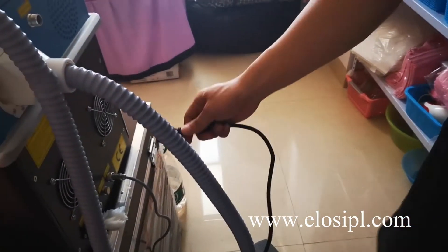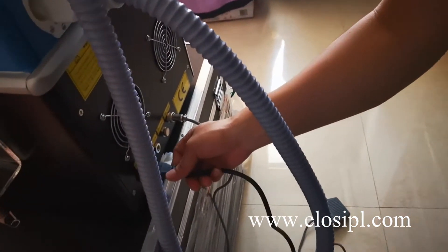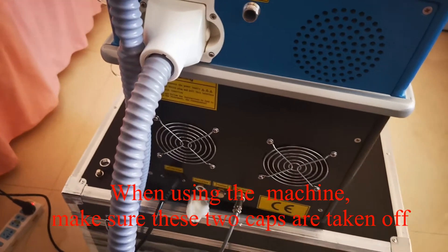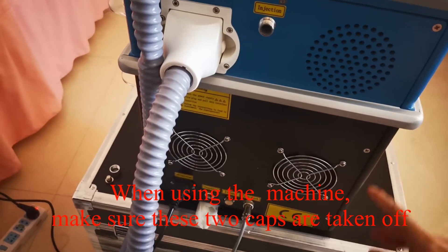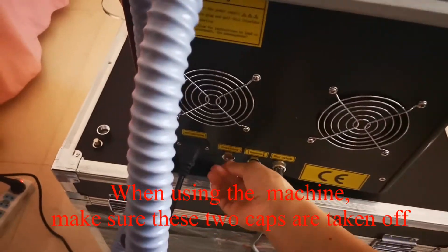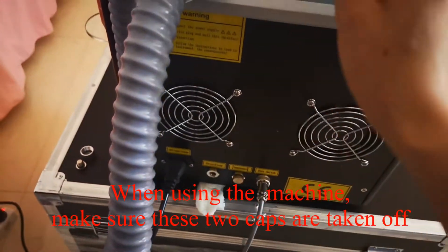Connect the power line. When we use the machine, we must make sure that the cap of the water inlet and water overflow are taken off.